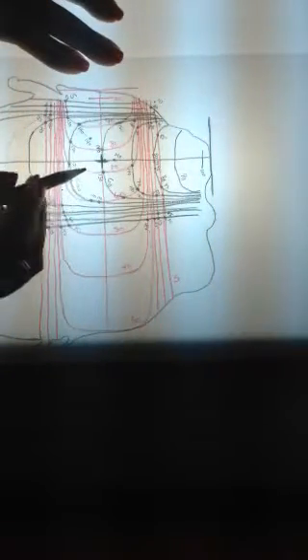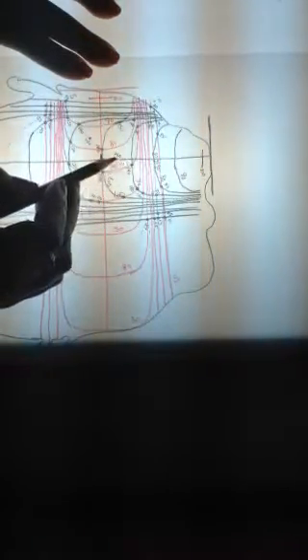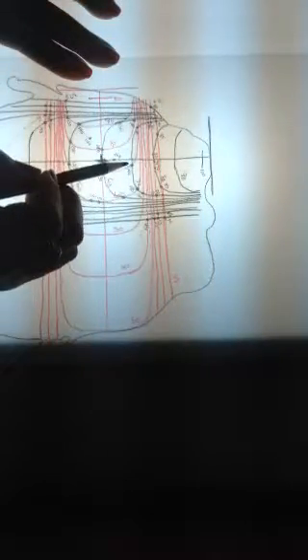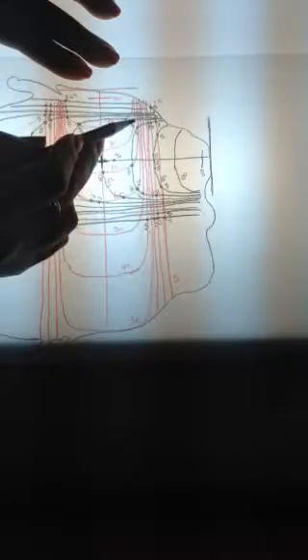So, as I was saying, after we've added the doses at various points at which the two beams intersect, then we begin to see a pattern. So, for example, over here in this section, we see a lot of high dose areas. 140, 140, 140, 140, 140.